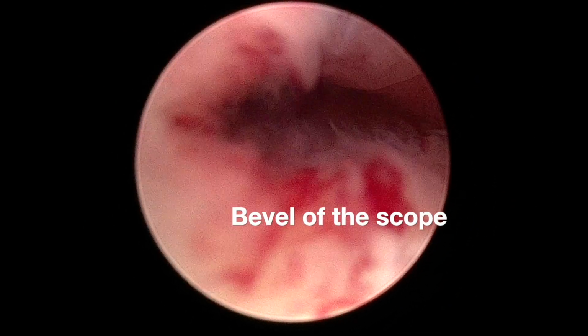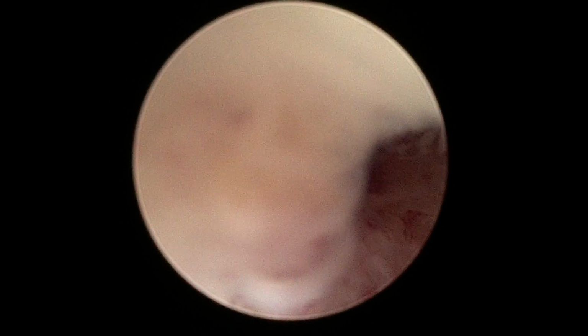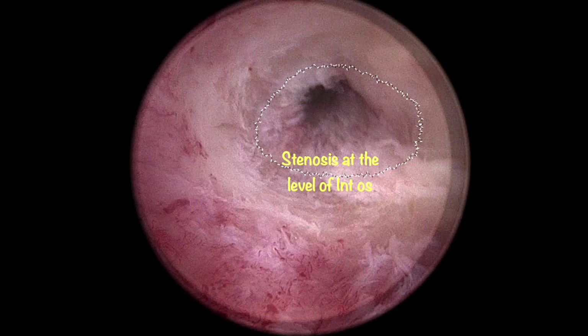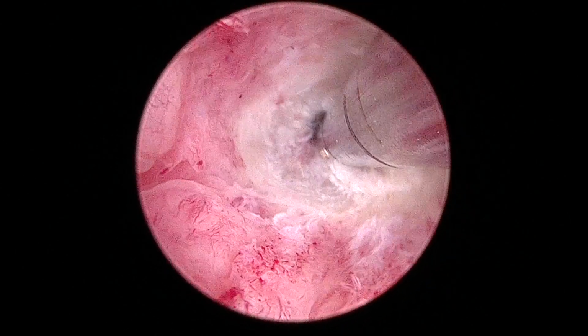And now, as we see, we are approaching the internal os, which is seen as a crescent, and this is approached with the bevel of the scope. The continuous flow irrigation helps us in distending the cervical canal and opening up the cervical canal and the internal os. But at the level of the internal os, you can clearly see there is stenosis. These fibers are white. They do not have any innervation and no vascular supply.